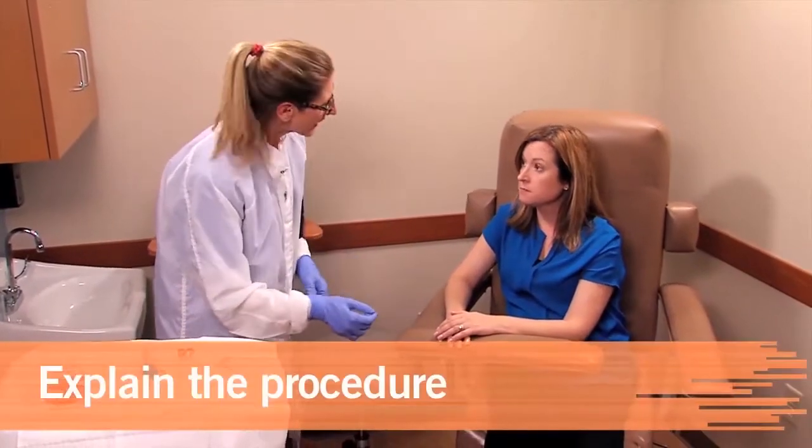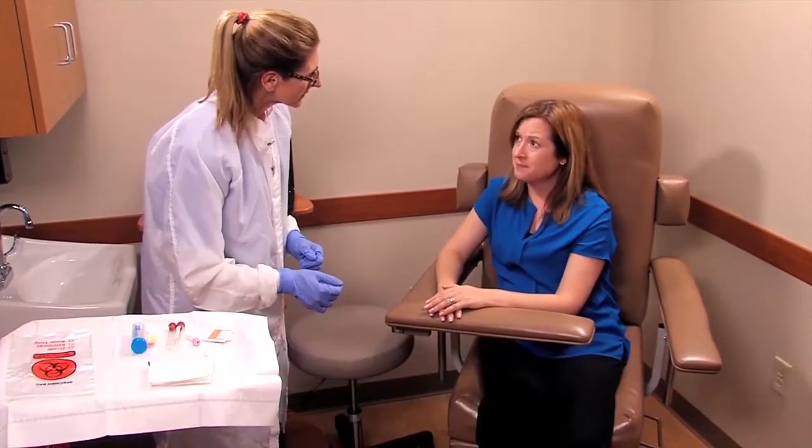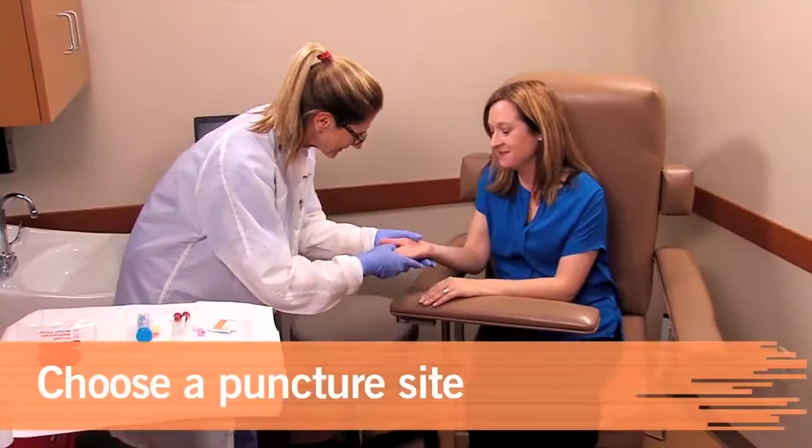You must explain the capillary puncture and obtain permission for legal reasons, but describing the procedure also encourages the patient's cooperation. Depending on the patient's age and the sample needed, choose a puncture site.